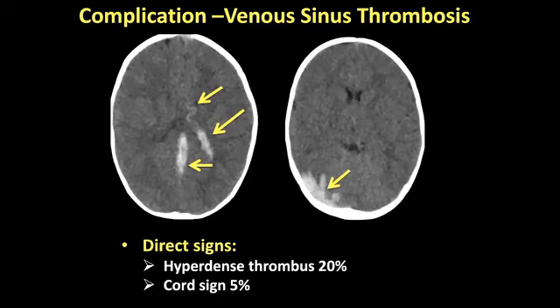So what other complications do we need to look for? We've talked about subdural hygromas and empyemas. We talked about abscesses and their mimics, particularly in the setting of tuberculosis in middle and low income countries. Now we need to consider venous sinus thrombosis. This is more common in infants and younger children, but is still a consideration in patients who have infection. So we have various signs that we can look for on CT.